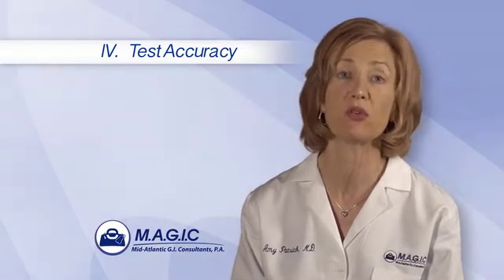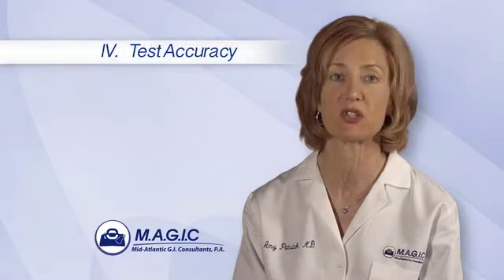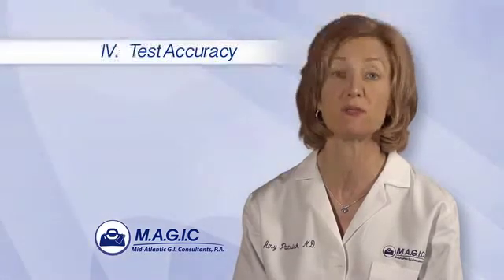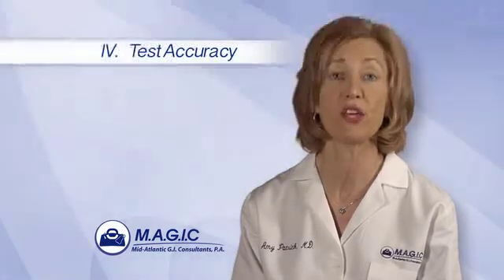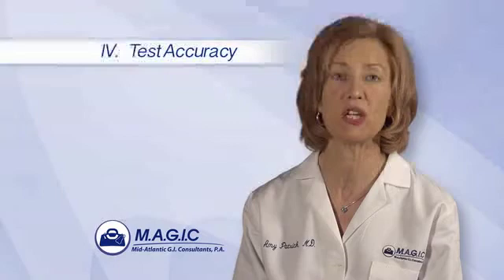You can help lower the risk of missed findings by strictly following all of your prep instructions to ensure a clean colon. Although your healthcare team is dedicated to providing the safest, most effective colonoscopy, they can make no guarantees about the positive outcomes of this procedure or its findings.